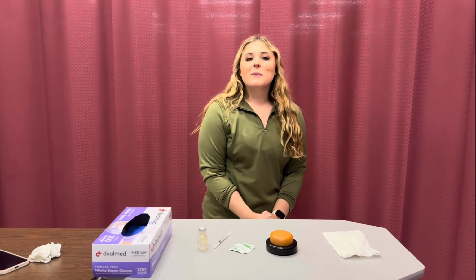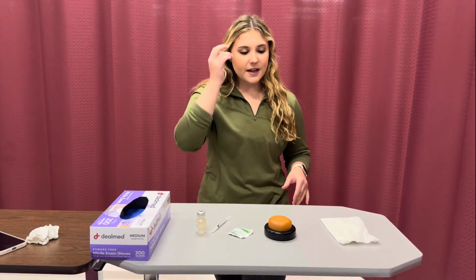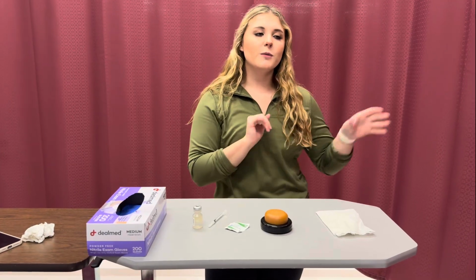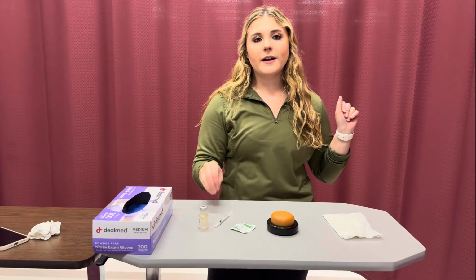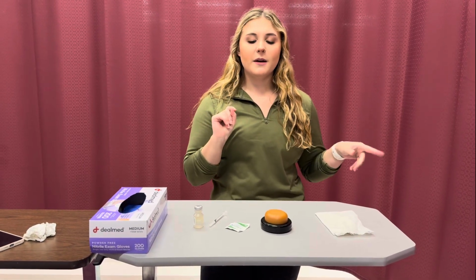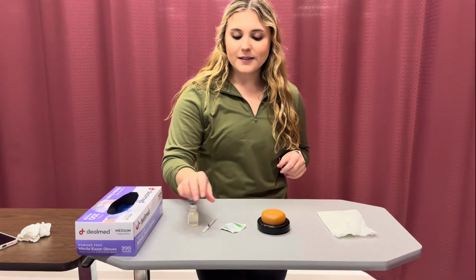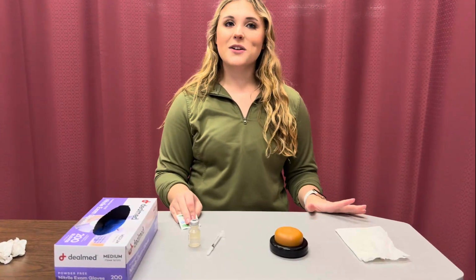Okay, I will also be performing how to do an intradermal injection using a TB skin test. So before entering my patient's room, I confirm with the doctor that there's an order. After entering the patient's room, I perform my 9 rights and confirm name and date of birth. I will tell my patient what I'm doing. I'm going to give you a TB skin test in your forearm.